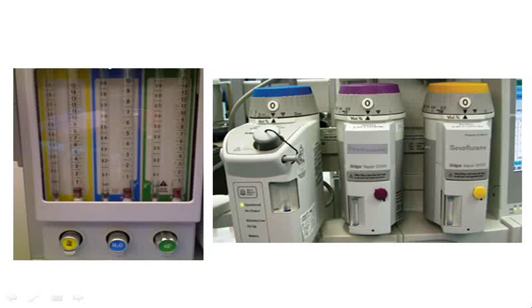liters. So if I'm here, that's 100 mLs, 200 mLs, 300 mLs, 400 mLs, and then that's a liter, 2 liters, 3 liters, 4 liters. So, everybody got that? Yeah. Say that again, sir. So if I'm here, the smaller tube on the left are mLs. So that's 100 mLs, 200 mLs, 300 mLs, 400 mLs. The one on the right is liters. 1 liter, 2 liters, 3 liters, 4 liters.